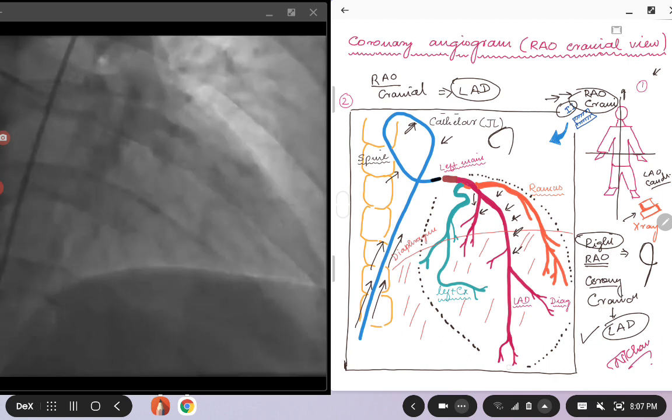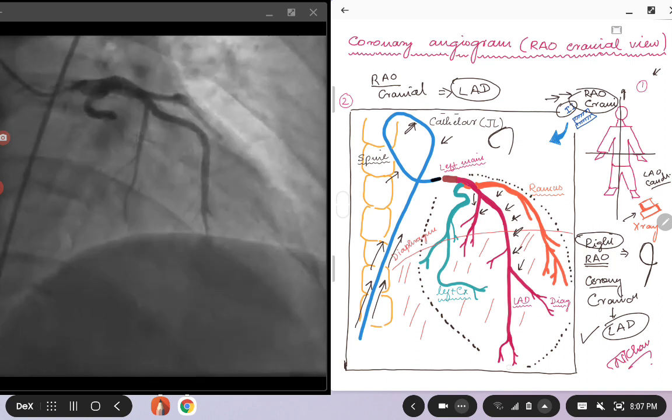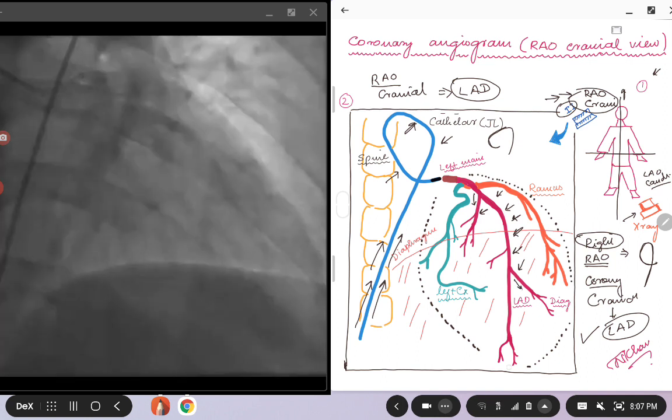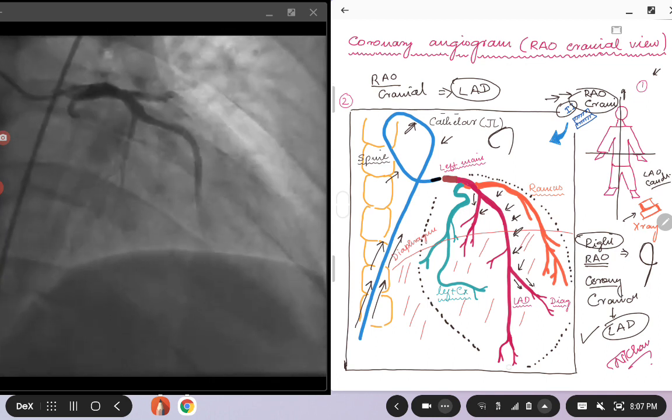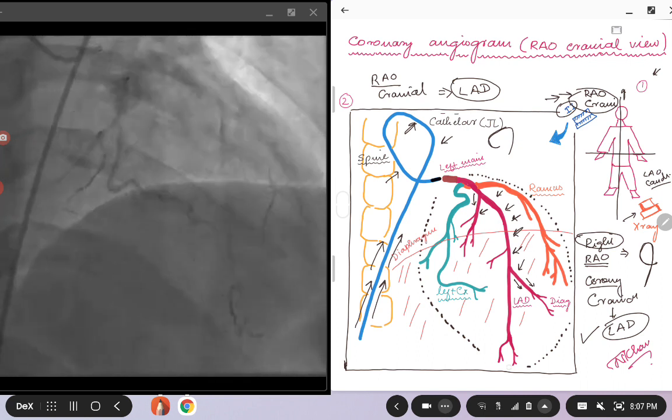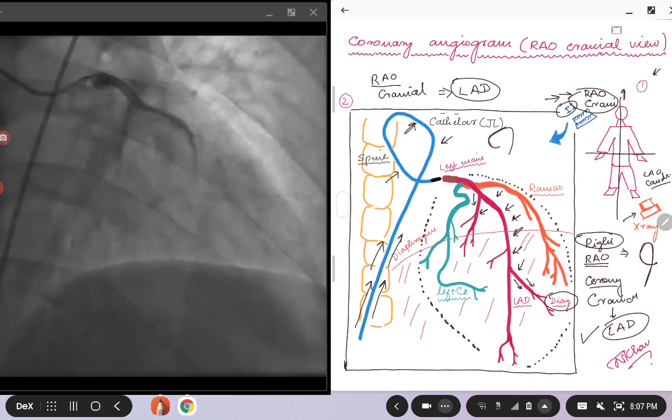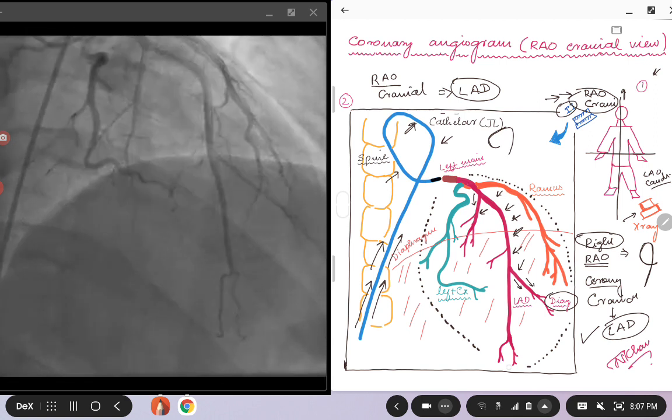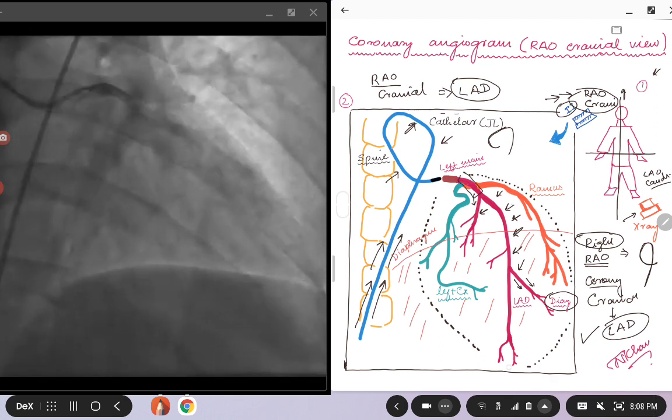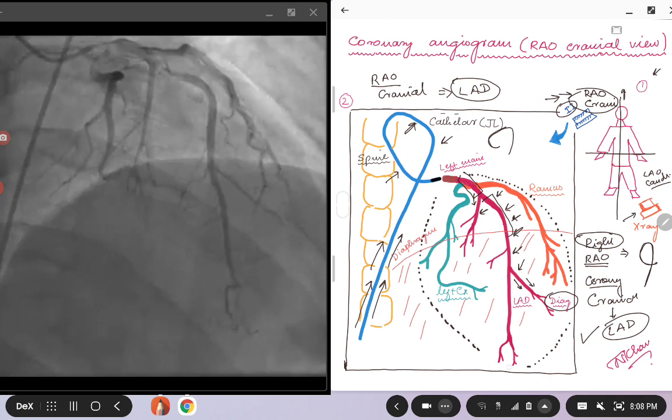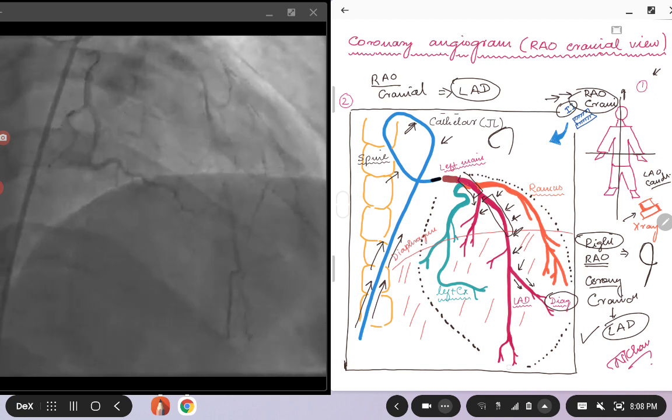What I want you to focus is that right around four o'clock position, you see this artery coming out from the LAD going towards the right side of your screen. That's your diagonal branch. This view, cranial view, will help you look at the septal perforators, the LAD, the prox LAD, the mid LAD, the mid to distal LAD, and also you will be able to look at the diagonal branches.